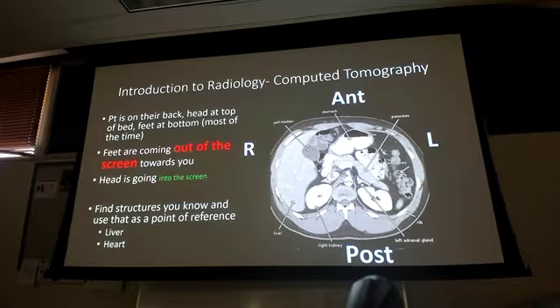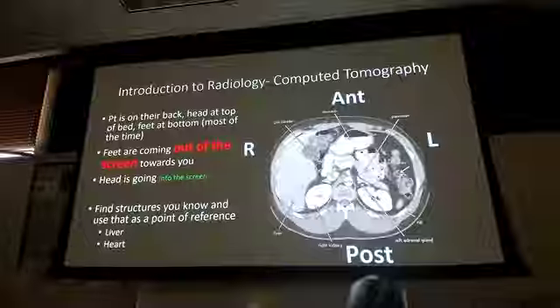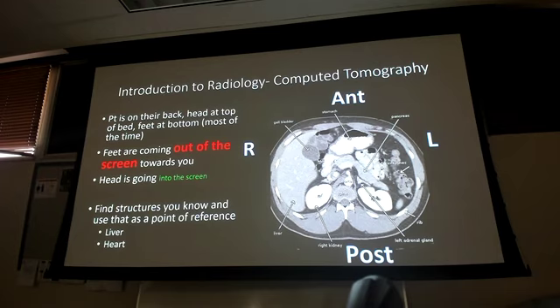It is set up as if the patient is looking at me and I'm looking at the patient, because that's how we do care, right? So that is how the image is going to present in that way. So always think about it, even from an x-ray standpoint, like if you have a chest x-ray, it's as if the patient's standing in front of you, and it's the opposite. Your left is their right, your right is their left. Okay, instead of trying to figure out feet and head, if you do it that way, you'll never be wrong.